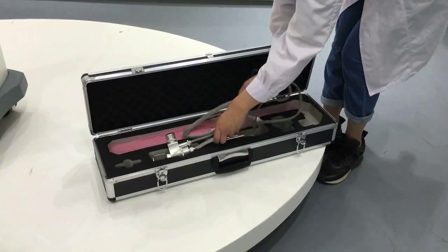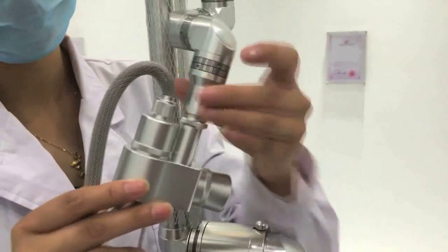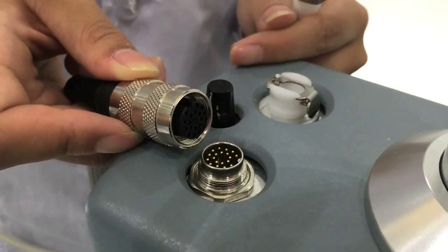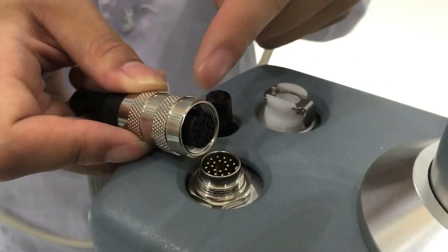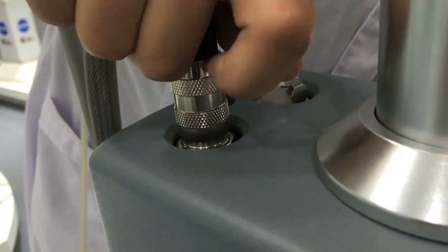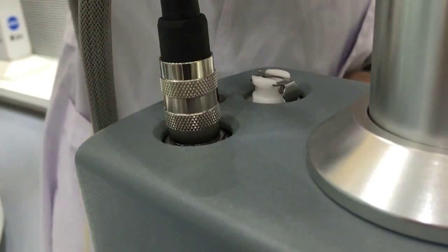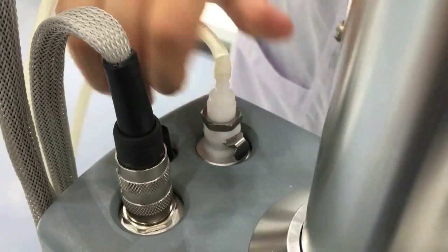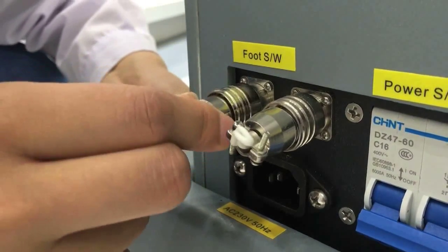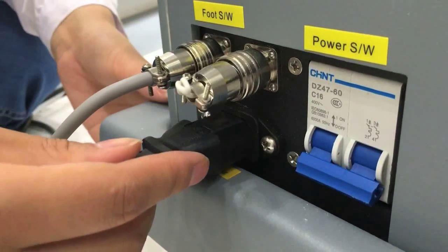Connect the handle with the joint arms. Insert the cable and air tube. Install the foot switch — there is an upward gap on the foot switch interface, insert it. Installation of the power line: plug in the power line.